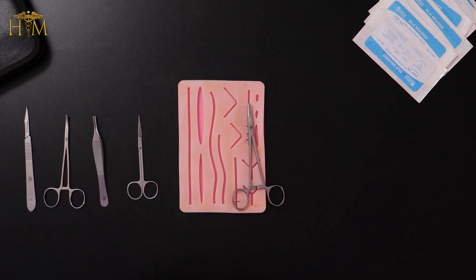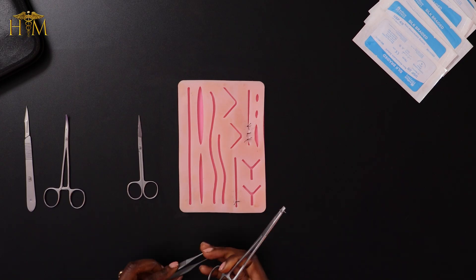I'm going to open up a brand new suture. The needle will be just in here, so I'm going to grab that with my needle holder. I want the needle holder at 90 degrees to the needle, about two thirds of the way along. If you don't remember how to put the needle on the needle holder, that's in episode one, so go back and have a look.